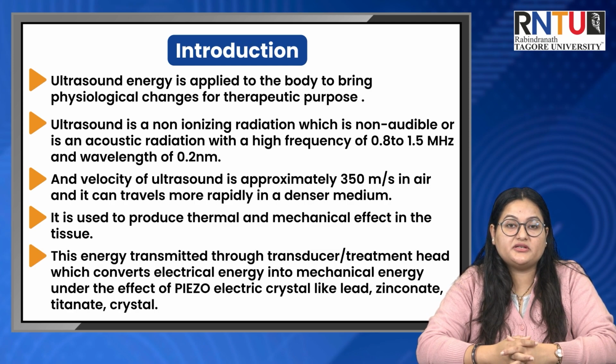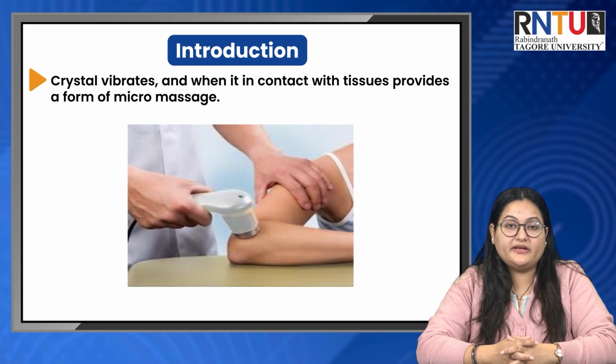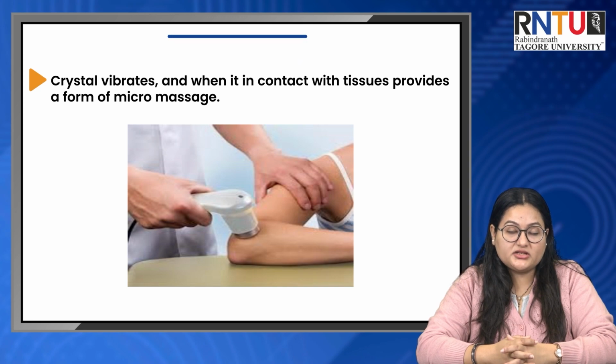This energy is transmitted through a transducer, or we can say treatment head, which converts electrical energy into mechanical energy under the effect of piezoelectric crystals like lead zirconate titanate crystals. Crystals vibrate, and when in contact with tissues provide a form of micro massage.